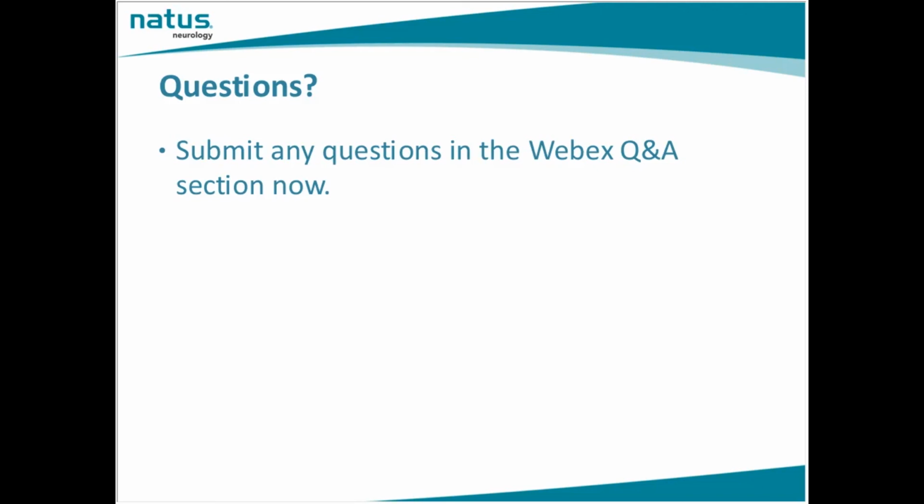Thank you very much. This is from Duke. What criterion do you use for vasculitis? Is it similar to vasospasm or native intracranial stenosis? Do you do vasculitis in your institution, Ann? Yes, we do see patients with vasculitis, and we are looking for vasospasm, so we use vasospasm criteria.